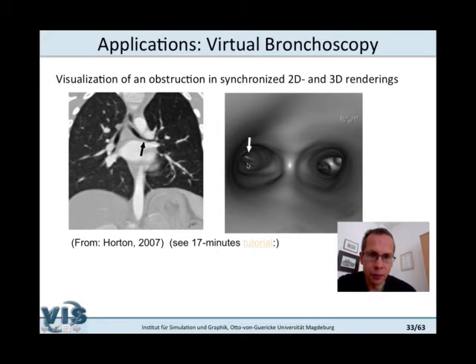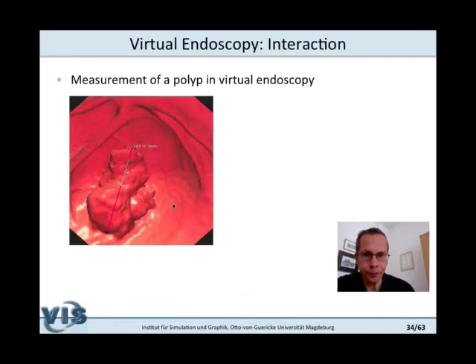Yeah, so the bronchial tree at this point is almost collapsed. Yeah, that's from Karen Horton's overview paper. By the way, I also want to recommend this 17 minutes YouTube tutorial that explains virtual bronchoscopy quite convincingly. Yeah, measurements, I said, are important.